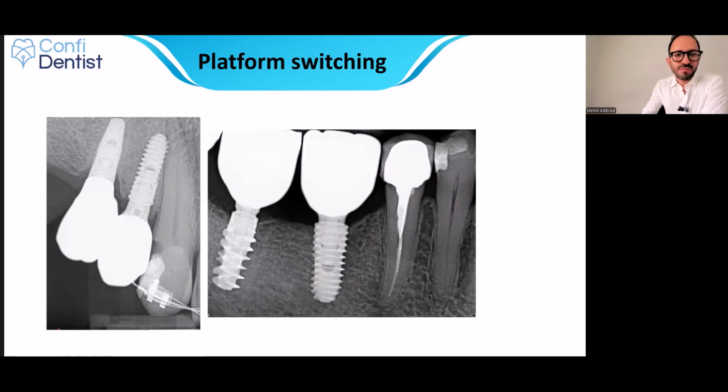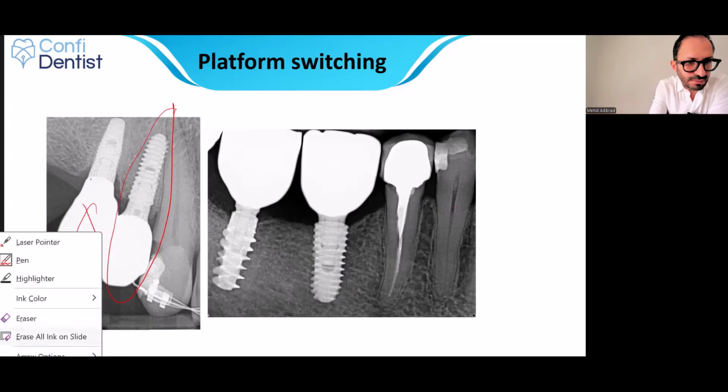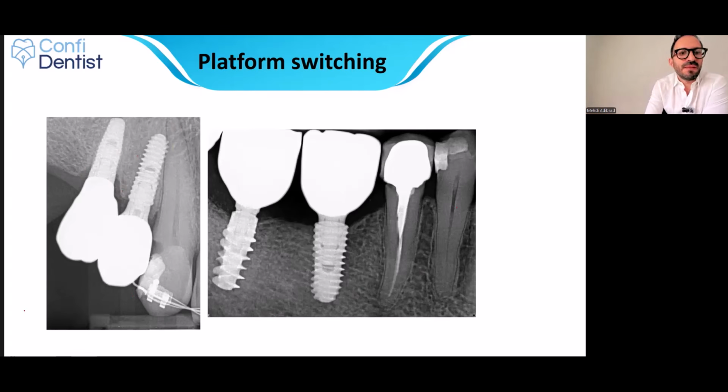This is another example, a really nice example. Actually, we have two implants, one with platform switching and the other one without platform switching. Okay. So this is the implant that I placed, another Hiossen implant placed probably several years ago. This implant was placed back in Iran by another surgeon. And you can see some evidence of peri-implant bone loss already here. Also some evidence of recurrent caries. And a composite restoration, bracket, and wires considered as orthodontic appliance.